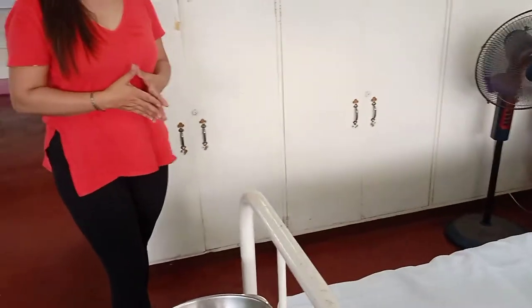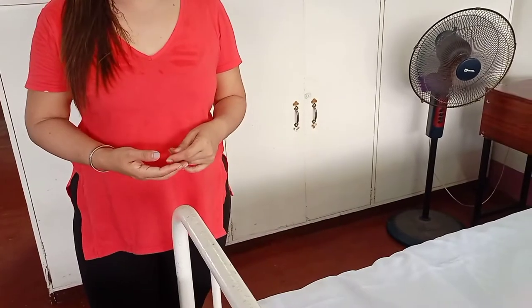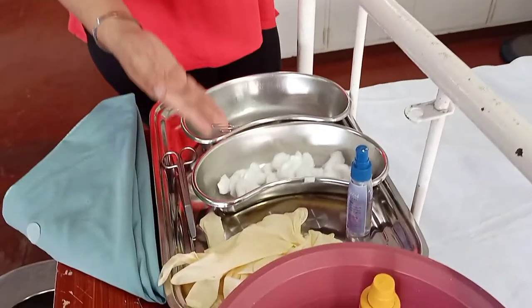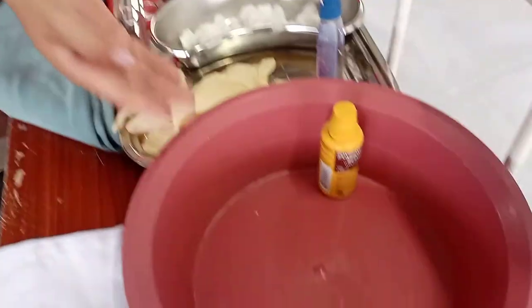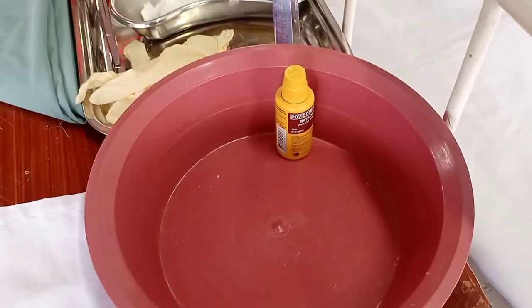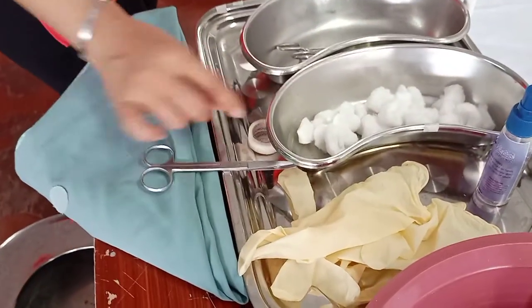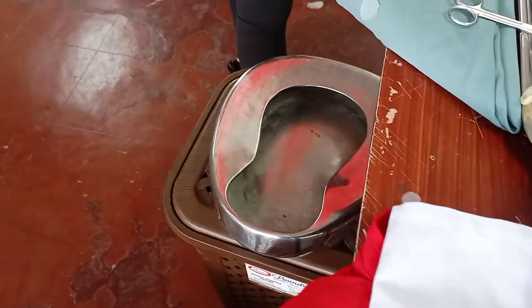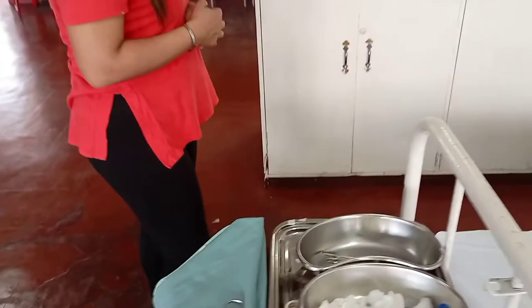Good morning. This time we're going to perform the proper catheter care for our patient. For our materials, we need three basins: one is empty, one with cotton balls, one with the betadine solution. We also need alcohol, a pair of gloves, and on the tray we need scissors, pre-cut tape, micropore tape, the diamond drape, apron, and a urinal.